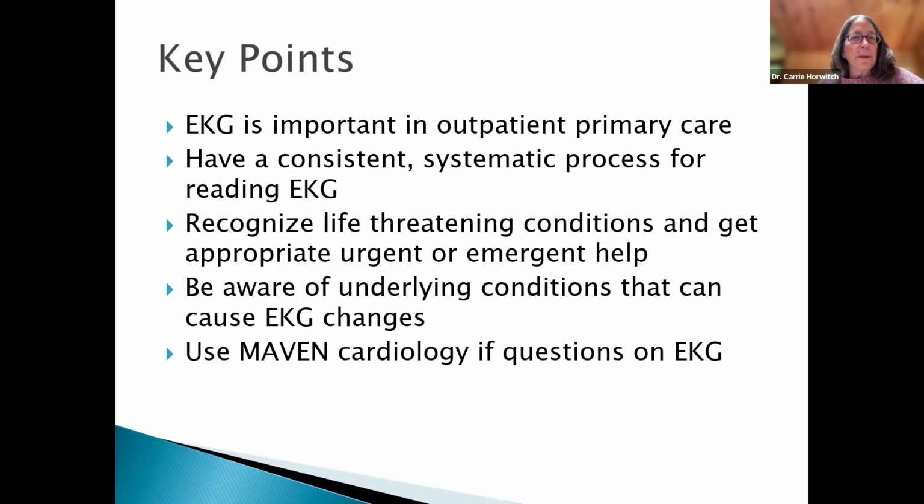So just going back on the key points, EKG, very important in outpatient. Have a consistent, systematic process for how you read it. Make sure that you look at some books and understand what is a life-threatening finding. And again, we do have MAVEN Cardiology for consults and more training if you want it.